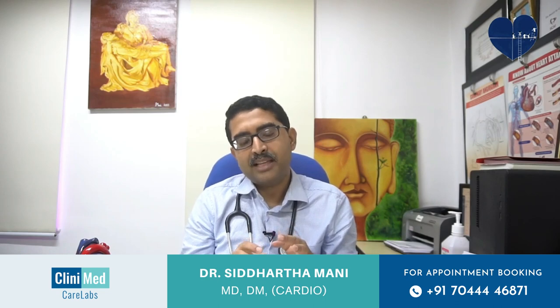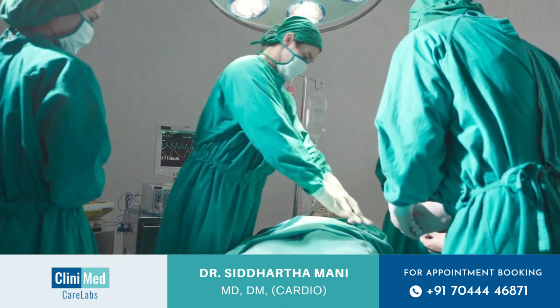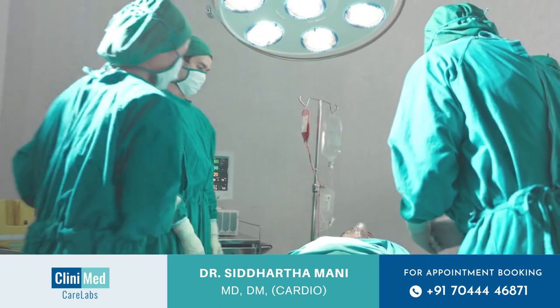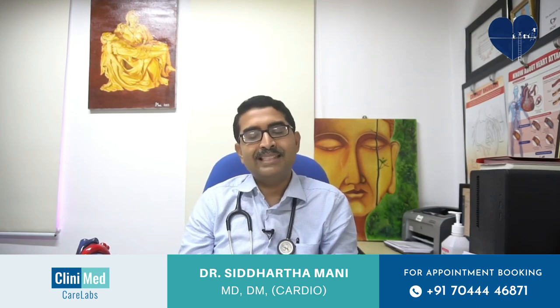Some of the pacemakers have the ability to give shock, electric shock, which you see in TV programs or some serials or films, that we give shock when cardiac critical arrhythmias occur. So that is also possible in advanced pacemakers, which we call AICD.